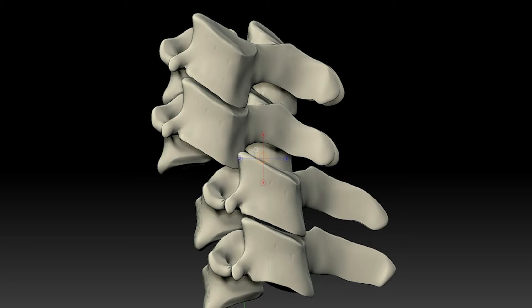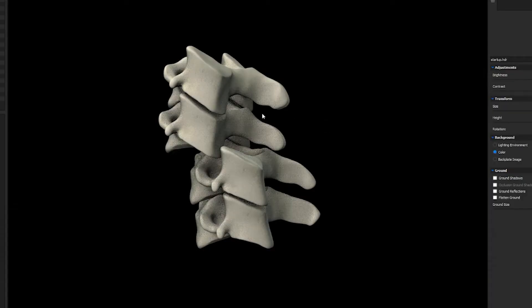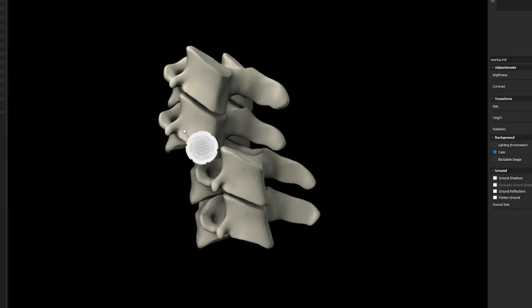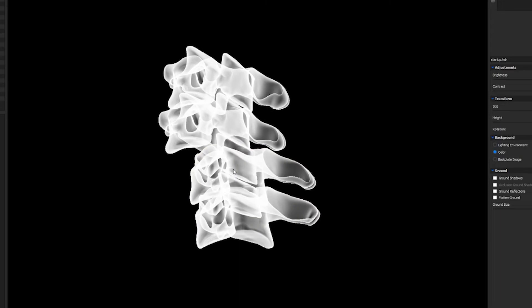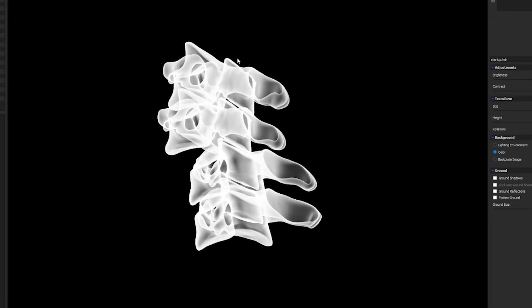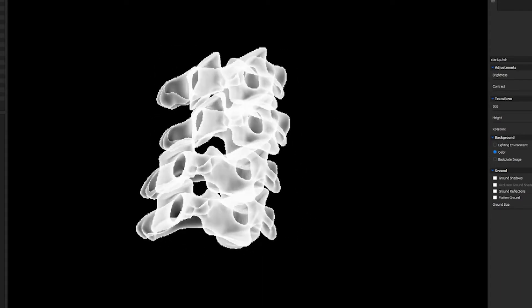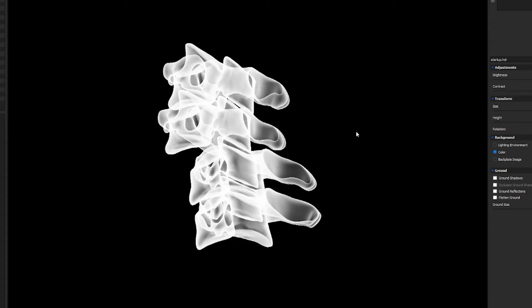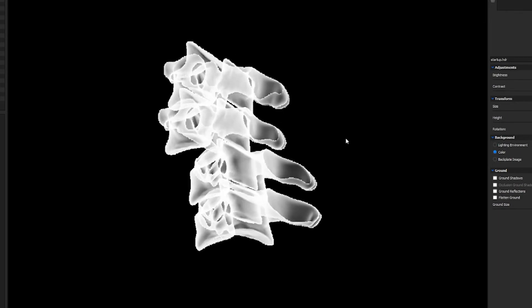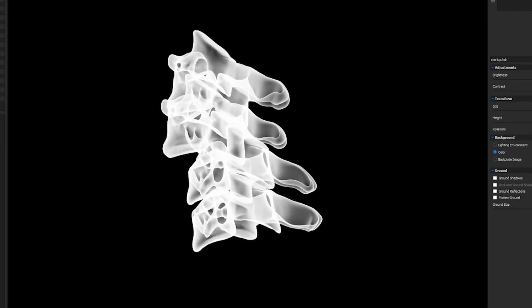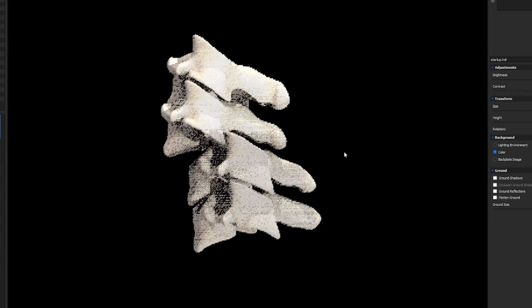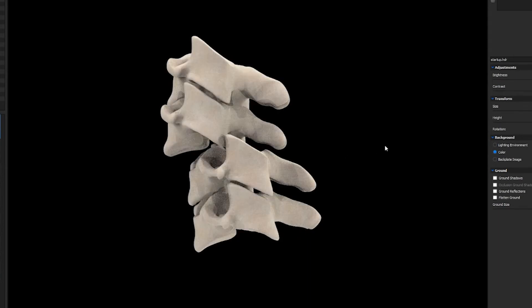Let's send that over to our renderer and see what that looks like in x-ray format. I'm going to change this over to x-ray view, and we can see how that looks. If we line these facets up nicely, you can see we've got our paired articular pillars over on this side, and then these ones also line up. Notice that there's some obliquity here at the level of the spondylolisthesis, and then we have a naked facet here and a naked facet here.